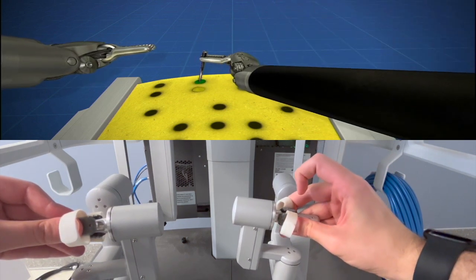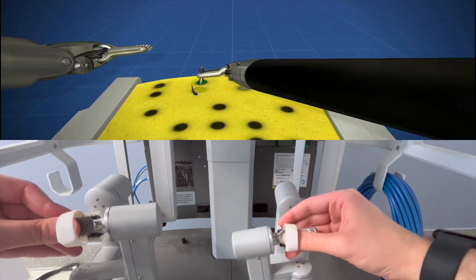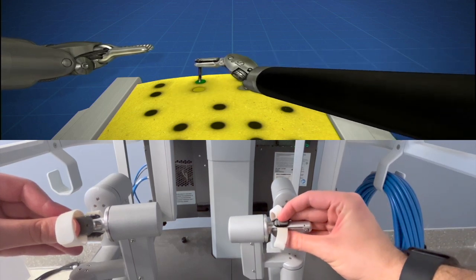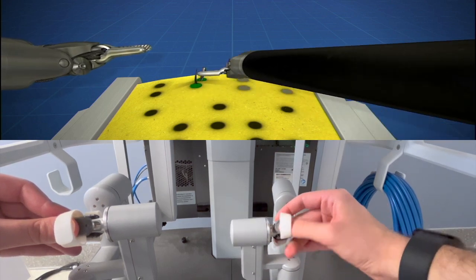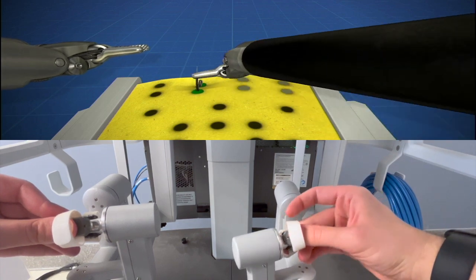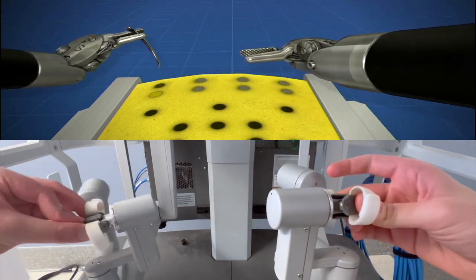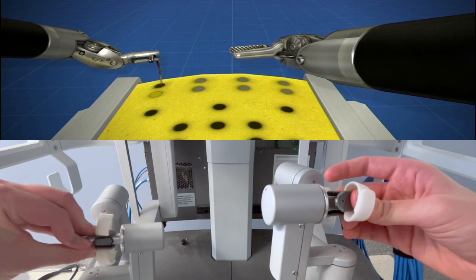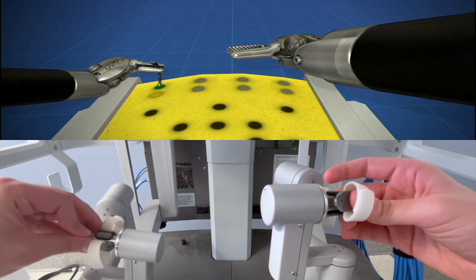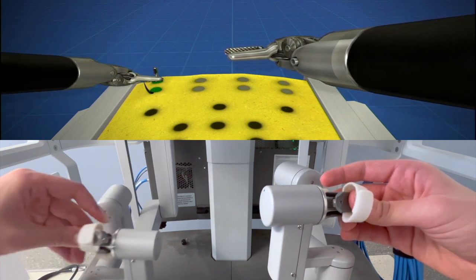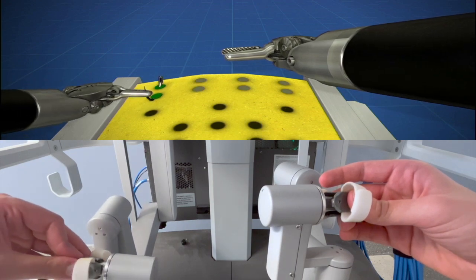As the needle emerges, I'm grabbing it with the arm that's opposite to the arm that's taking the bite, and I quickly switch hands. As you can see here, instead of trying to reposition the needle on the arm that's taking the bite, which would again require more time.